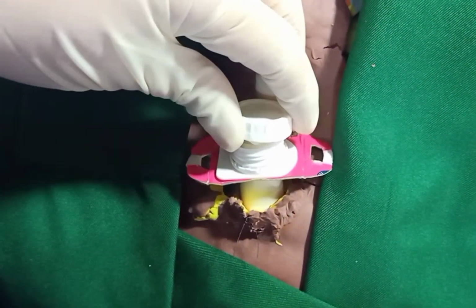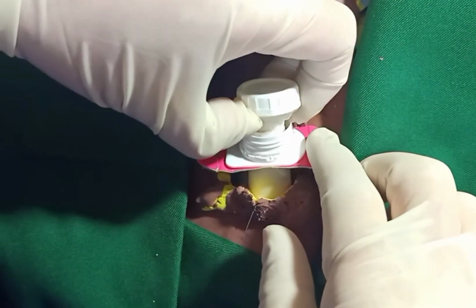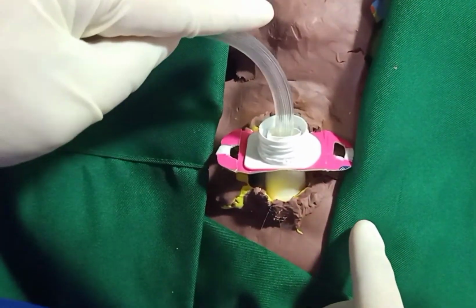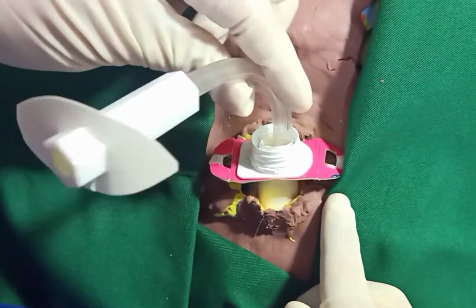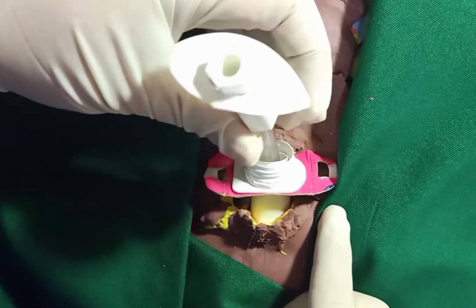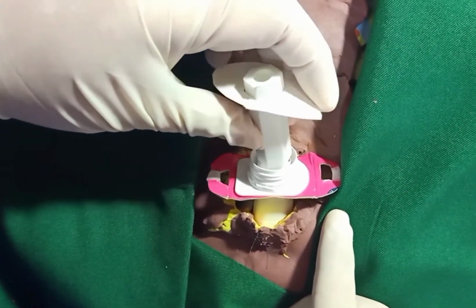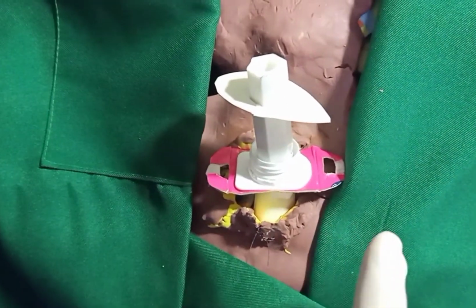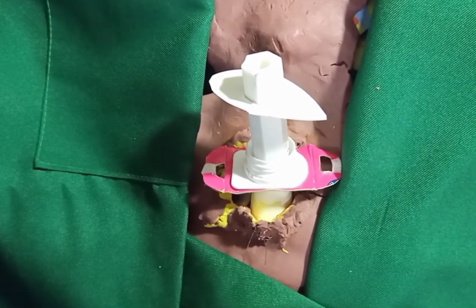Once the tracheostomy tube has been advanced, inflate the cuff, remove the obturator, then insert the cannula and connect it to the ventilatory circuit. Now ventilate while confirming correct placement of the tube within the trachea by checking the expired PCO2 levels of the patient and checking for chest movement or listening to breath sounds.